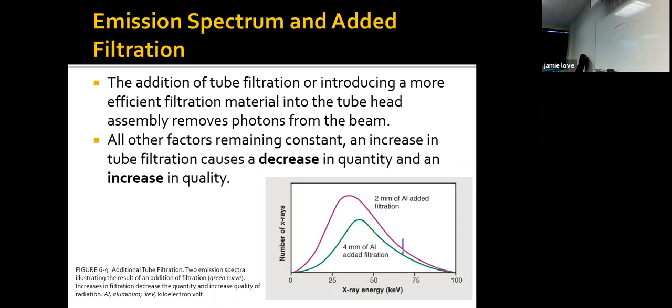The other type, letter B, is the boomerang filter. Never seen this either. Would like to use one, but I've never seen one used. It's under the shoulder. So the outside of our shoulder is really kind of not a lot, just a little bit of skin. But over here we have a lot of muscle and the scapula behind it. Where the joint space actually is, it's hard to penetrate. So we need to use a lot of kVp to get through that. But over here we have a little piece of bone called the greater tubercle. If you move your shoulder in and out, you can feel it rotate, little bump, that gets burned out.